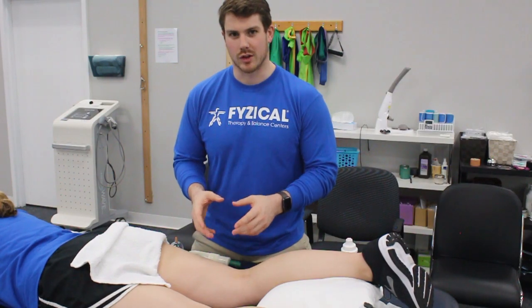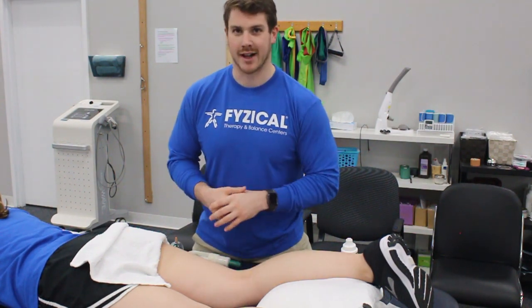When it comes to medical cupping of the hamstring area, today I'm going to focus on the medial portion of the hamstring — the inside — where normally a lot of people are tight, and it can lead to pain in the back of the knee and on the inside of the knee, depending on if you have trigger points or just tightness in the muscle.